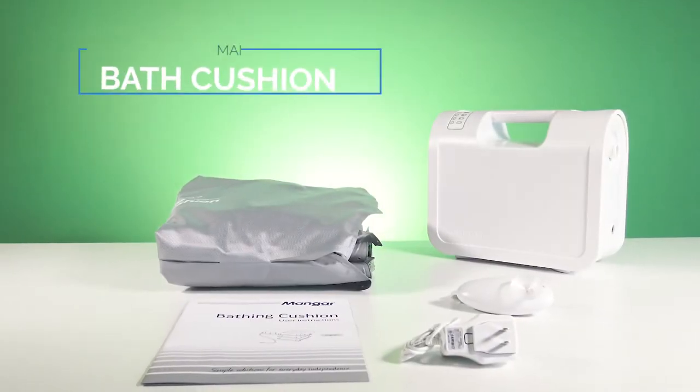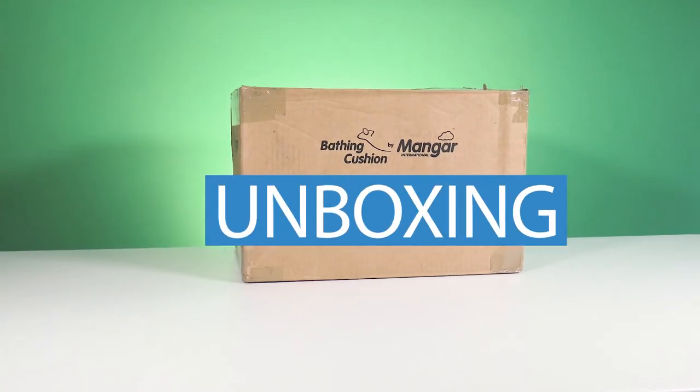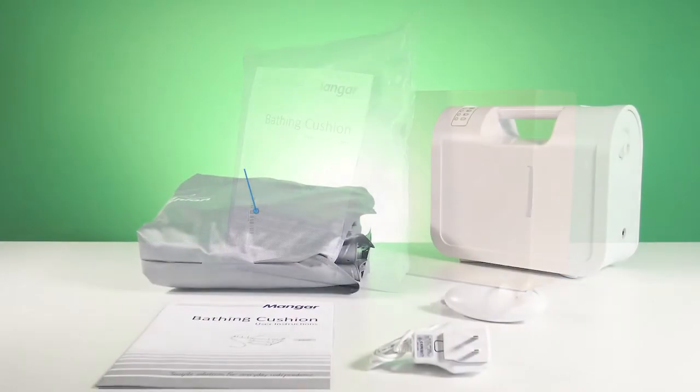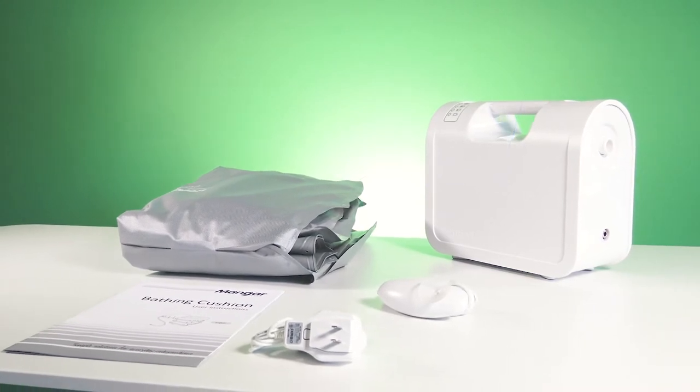Mangar calls its bathing cushion the world's most comfortable bathtub lift, and when you compare it to other bathtub lifts, it's hard to argue otherwise. Inside the box you'll find an elegant yet simple solution that makes use of pneumatic battery-powered lifting technology, deflating to lower you into the tub then inflating to help you get out.